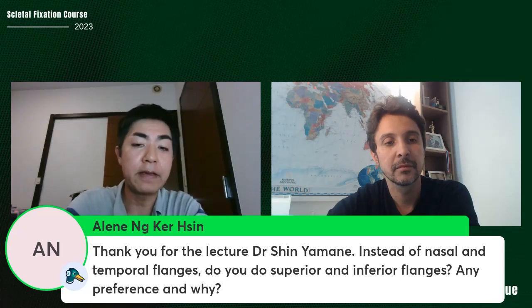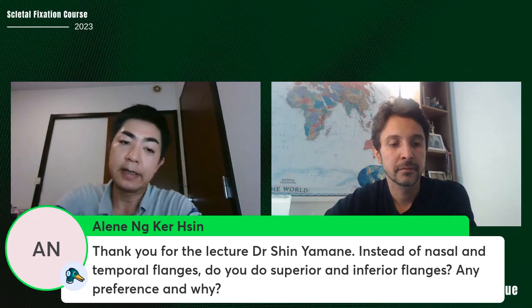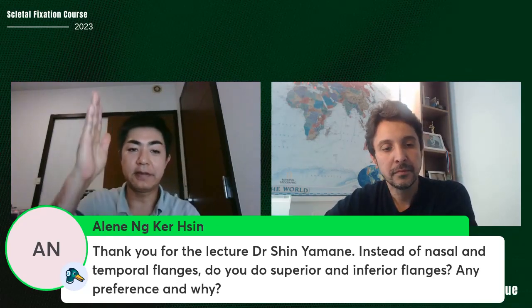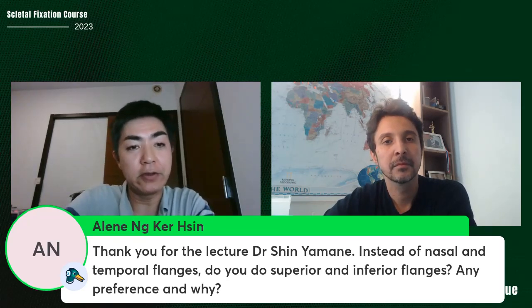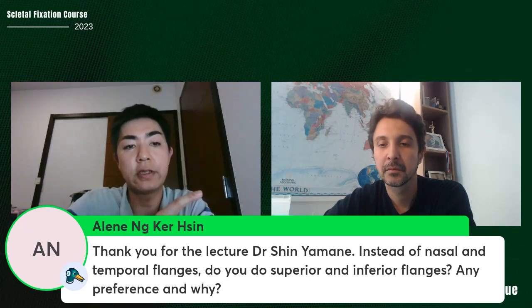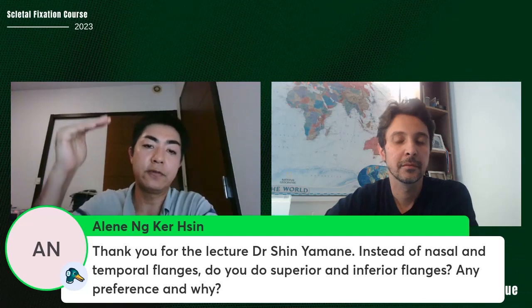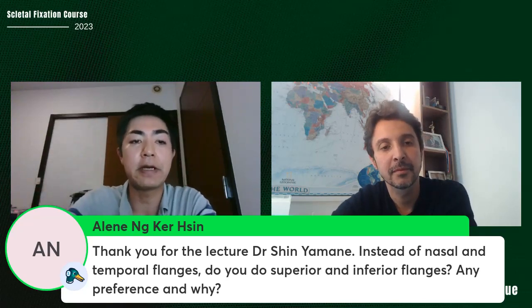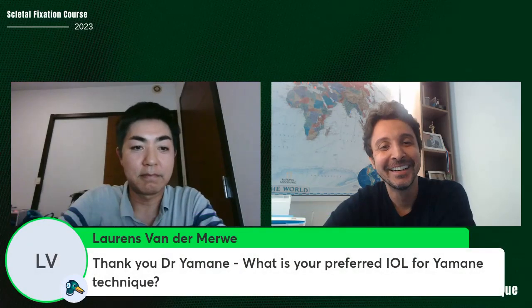I always make the flange at the nasal and temporal side position. I didn't try the vertical fixation. I don't know which is better, but in a paper from the US, conjunctival erosion occurred frequently if they fixed the flange on the superior and inferior side. I don't know why, but the paper said that. Next.